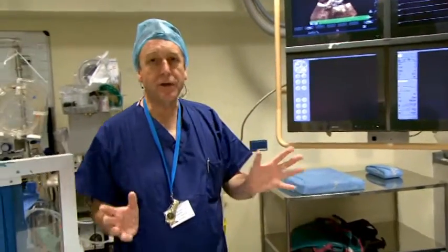Obviously, as you'll see during the cases, there are nurses, anaesthetists, and other staff working in here. And so the whole layout, how it all fits in with the patient, will become more obvious to you later on. But I just wanted to point out a few specifics from the point of view of echocardiography during these procedures.